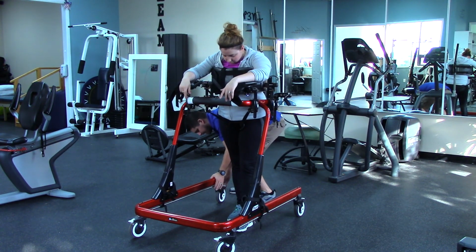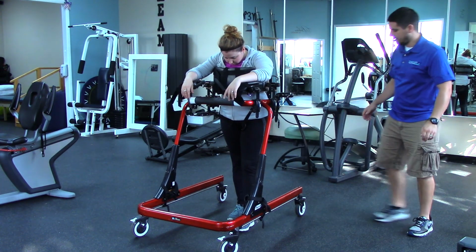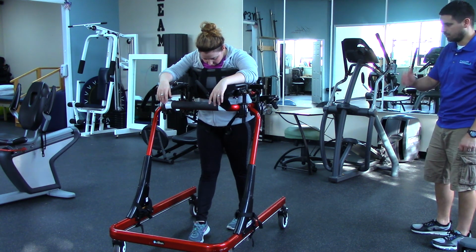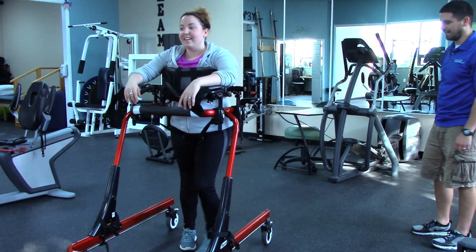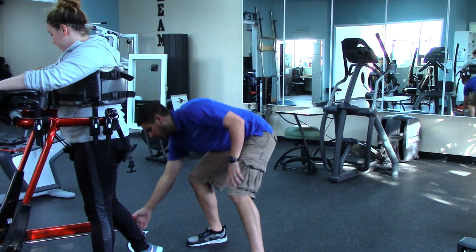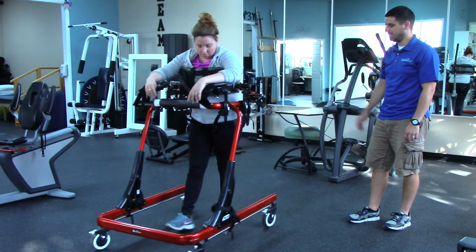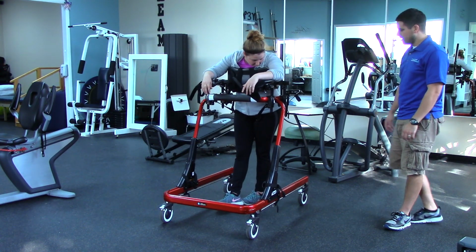And then let's say someone maybe likes to take a few steps forward, but then they always start falling back. So we can lock out the wheels like that. And now I've also put the directional locks in so that they can't go backwards. They can only progress the unit forward. From here, we're going to have to do a U-turn. We're going to have to turn completely around. So there's that option too. If we don't put these wheel locks on, then it's not going to work. You're going to hear a click, but it's not actually going to stop the unit, because the wheel locks have to be applied so that the casters can't turn, like the caster locks.